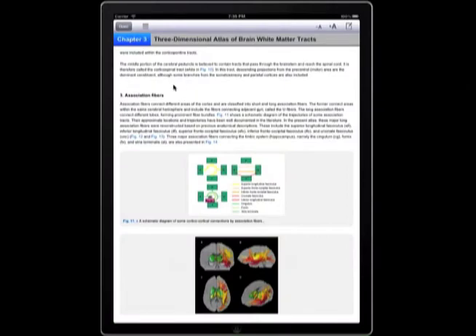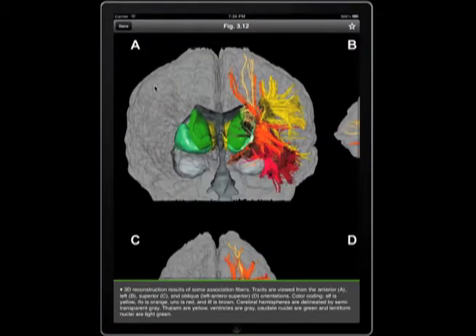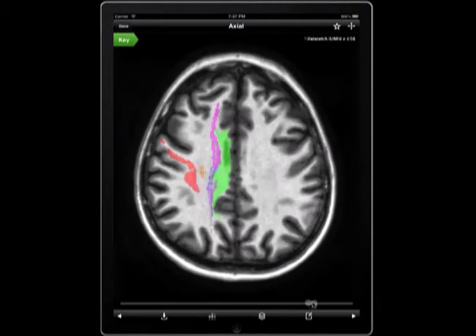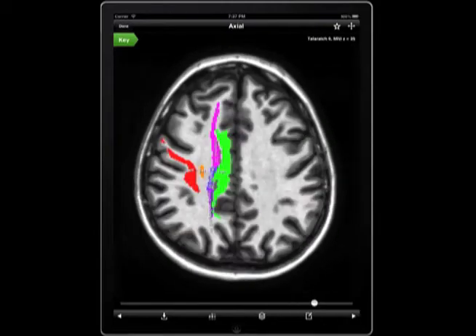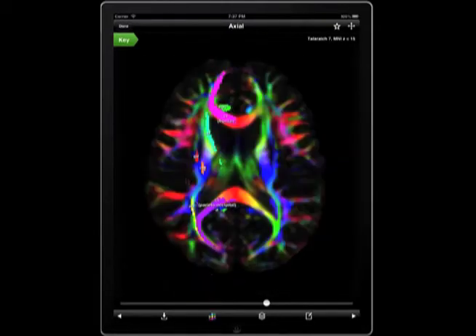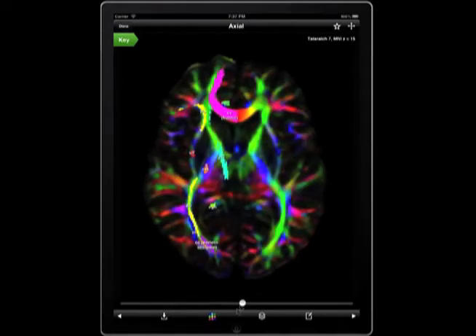Zoom in on your selected image and you'll get higher resolution and better clarity than can be viewed in print format. This app also allows you to scroll through images much like a true MRI, and since the tracks are color-coded, you can easily follow the same structure as it moves through the brain images.